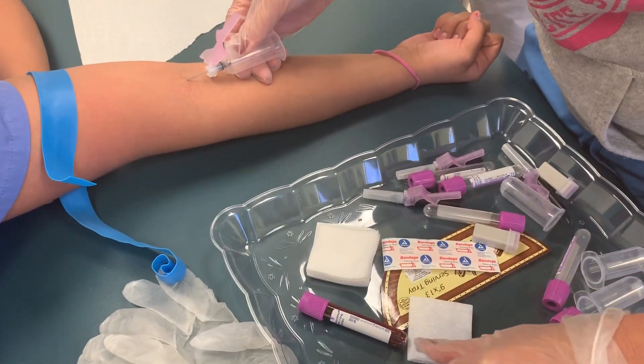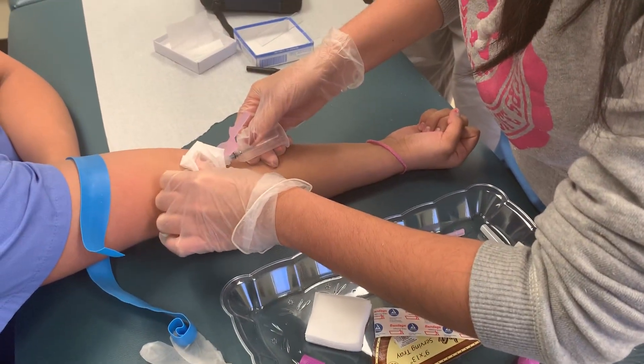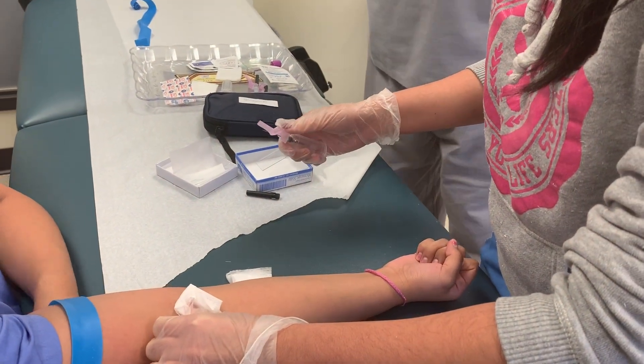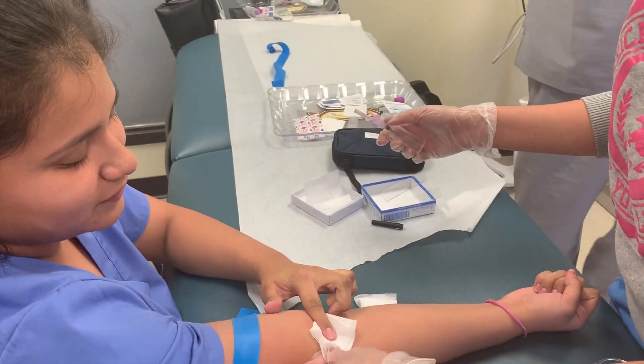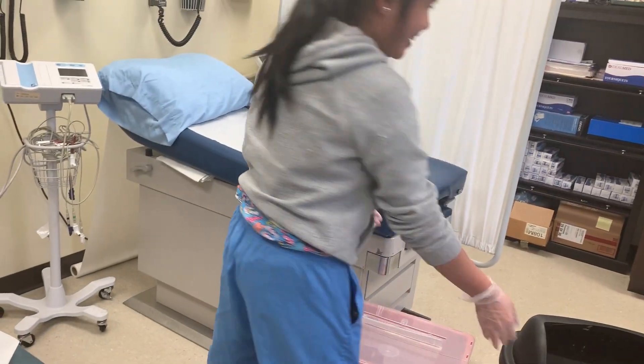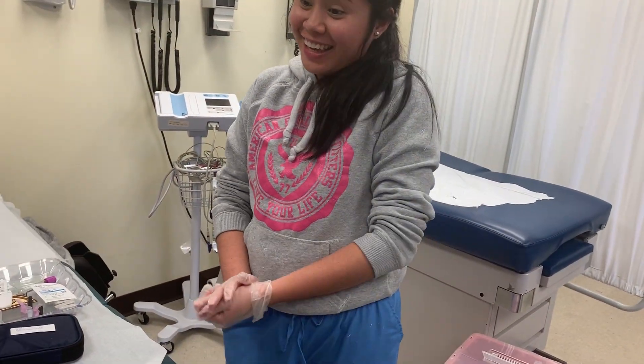Take the gauze. Okay. Activate safety. Ask her to apply pressure. Very good. Good job. Dispose. Thank you.